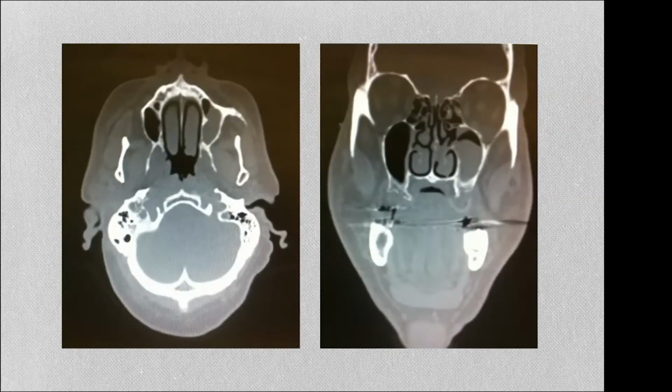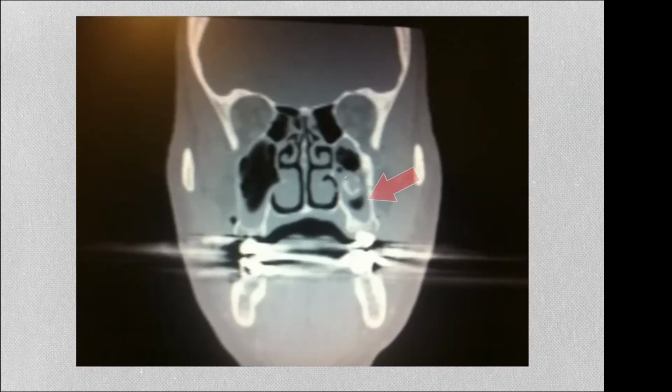And so when we look at CT scans, this is a hospital CT scan. We see this is a significant sinus disease. It's filling up the sinus. And even though we have roughly about 6 or 7 millimeters, just drilling in this area poses a risk. A small puncture, even inadvertent, even microscopic, can cause major failure. But worse, this mucus that could be infected can cause infection in the bone, like osteomyelitis or the sorts. And when you see calcification, this has to be sorted out. Is it because of a benign process or more malignant or otherwise?